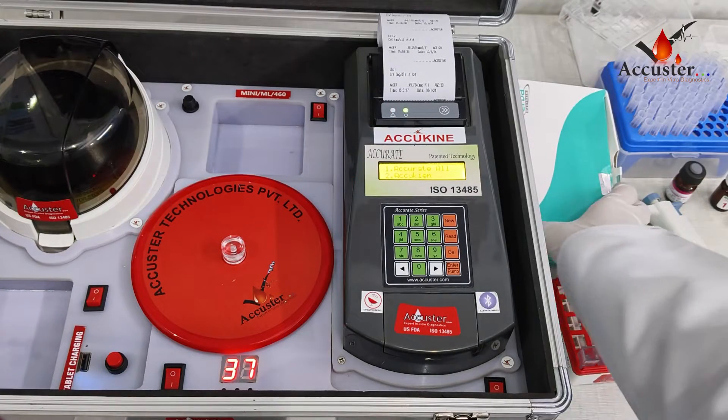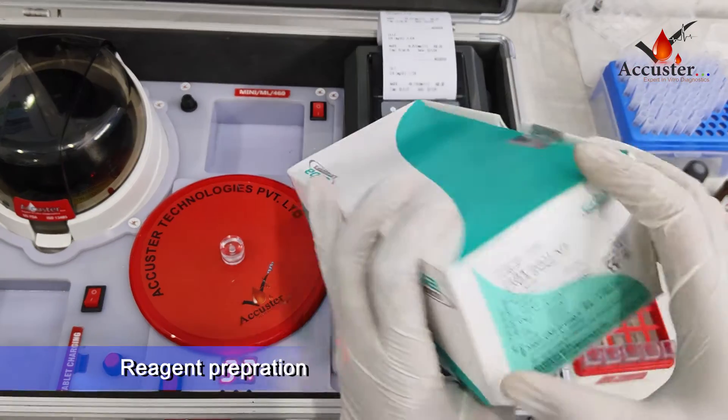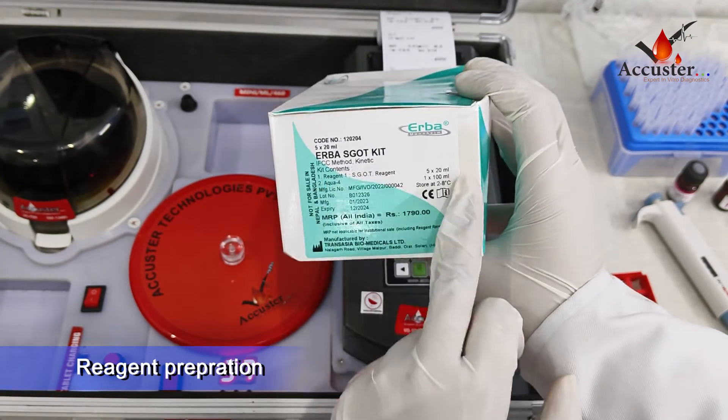We will do the SGOT test in kinetic mode. For this, we have Erba brand reagent.